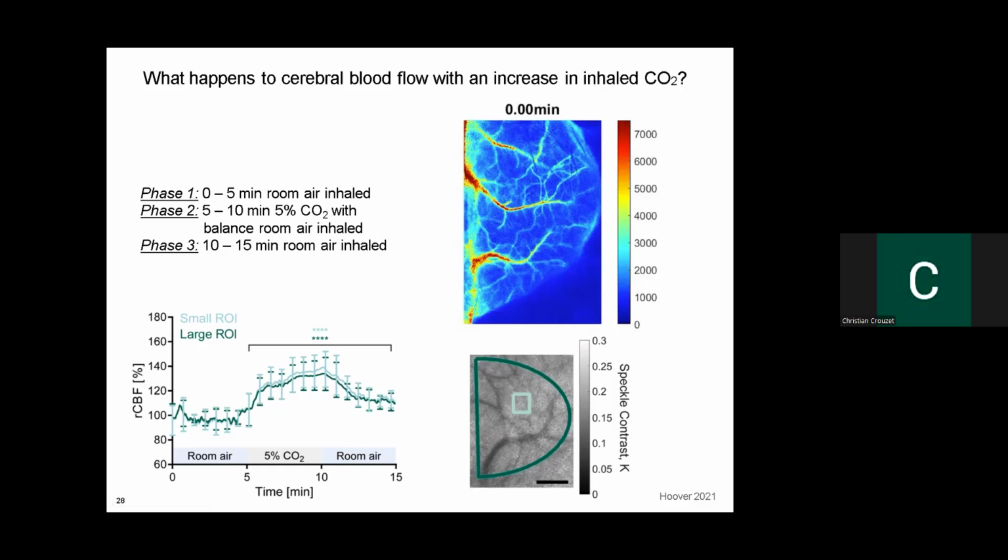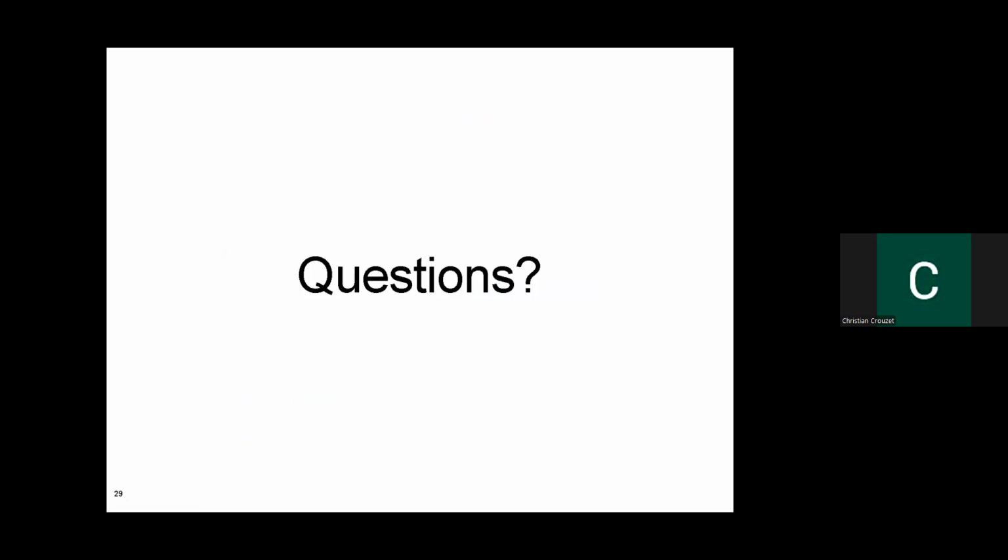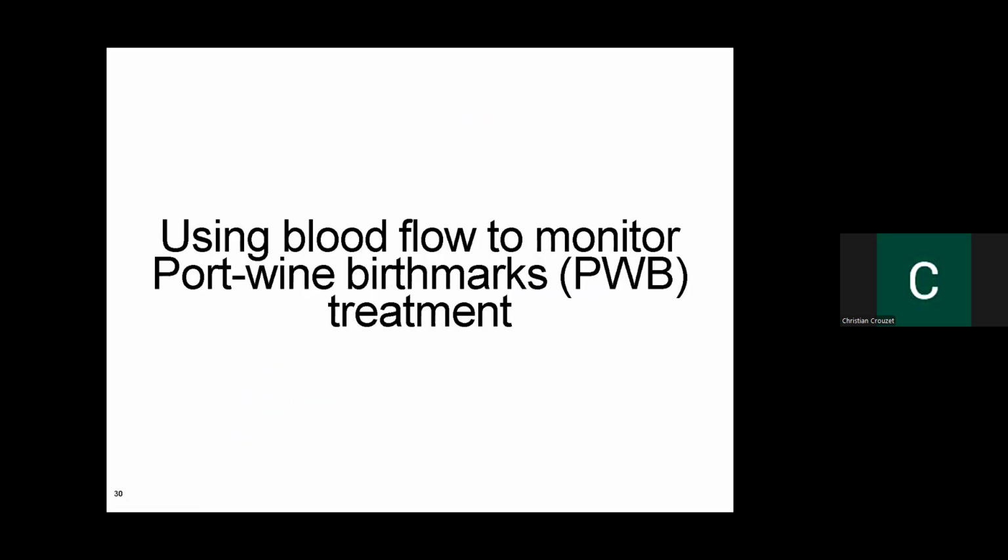Okay, a lot of good questions. So now I'm going to get into the applications that have been done in the lab. The first application I believe that Bernard started in the lab using laser speckle imaging was to look at port wine birthmarks, especially trying to monitor blood flow during treatment.